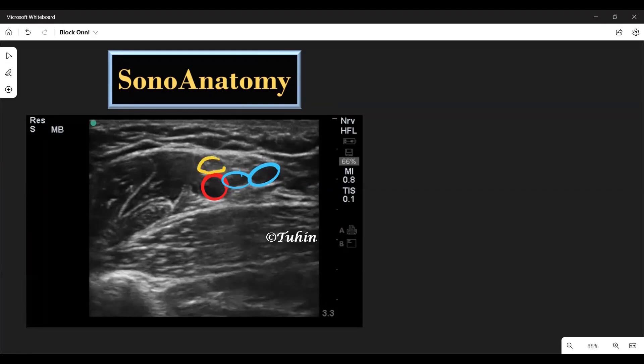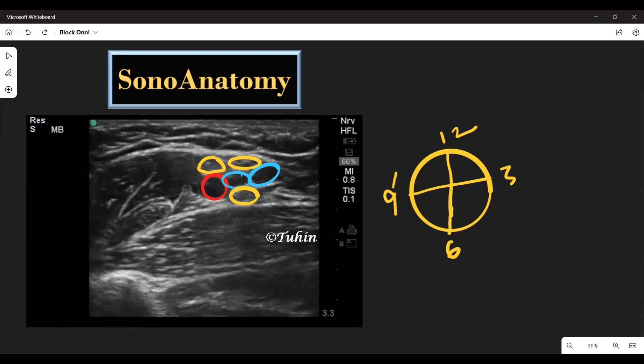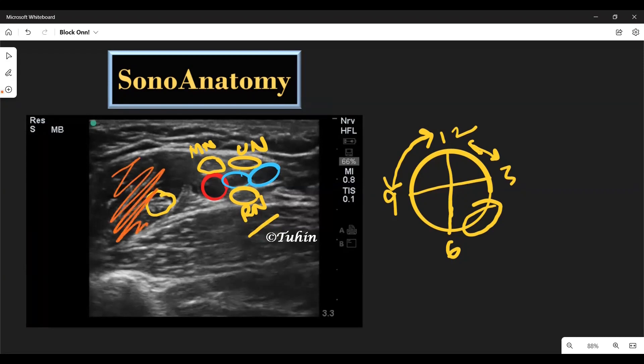The nerves, or the terminal branches of the brachial plexus, are located around the axillary artery. The median nerve is usually located at the 9 to 12 o'clock position, the ulnar nerve at 1 to 2 o'clock position, and the radial nerve around 5 or 6 o'clock position. From anatomical knowledge, this could be the median nerve, this one is the ulnar, and this could be the radial nerve. The musculocutaneous nerve is usually located a few centimeters away from the axillary artery in the substance of the coracobrachialis muscle, or in between the fascial plane of coracobrachialis and biceps brachii muscles. The musculocutaneous nerve appears as a hypoechoic triangular or oval-shaped structure with hyperechoic borders, as you can see here.